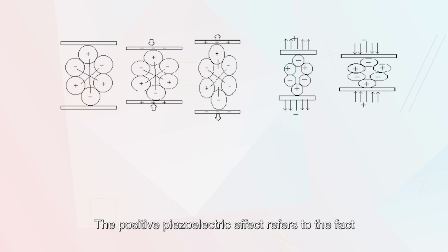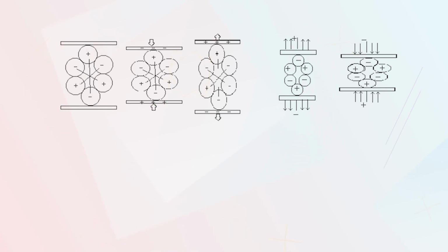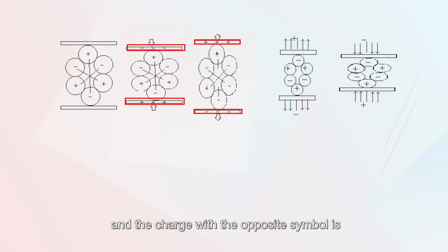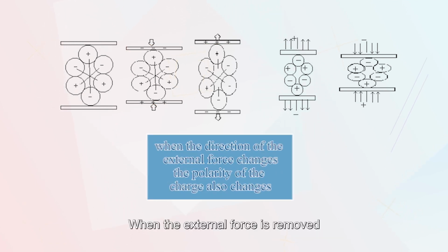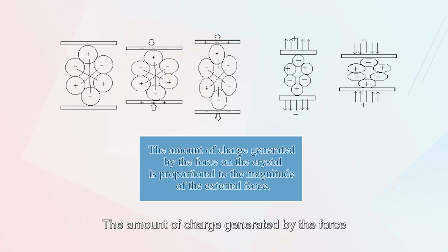The positive piezoelectric effect refers to the fact that when the crystal is subject to the action of an external force in a fixed direction, internal polarization is generated, and charges with opposite signs are generated on two surfaces at the same time. When the external force is removed, the crystal returns to an uncharged state. When the direction of the external force changes, the polarity of the charge also changes. The amount of charge generated by the force on the crystal is proportional to the magnitude of the external force.